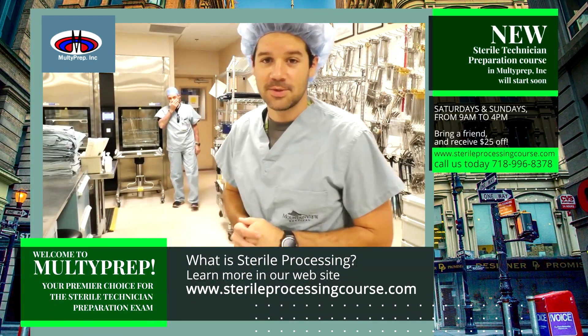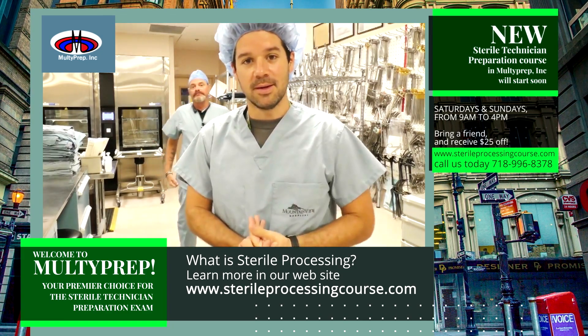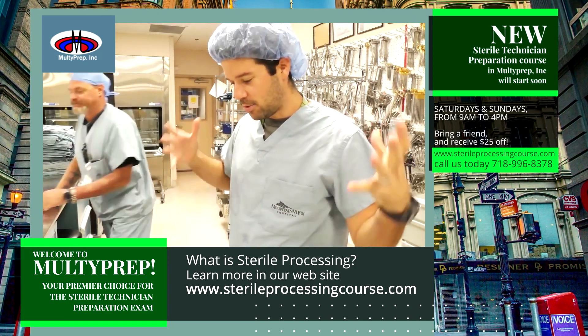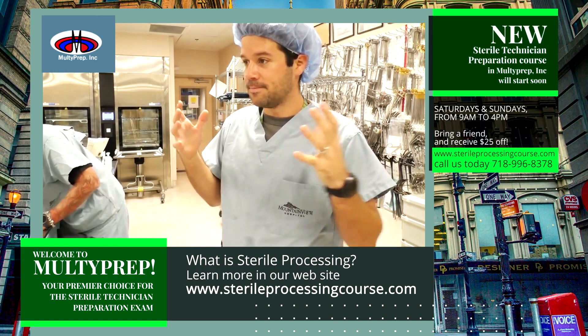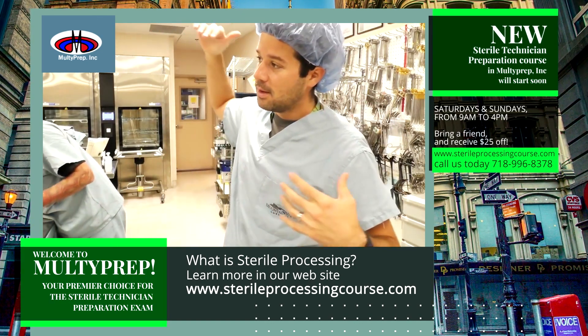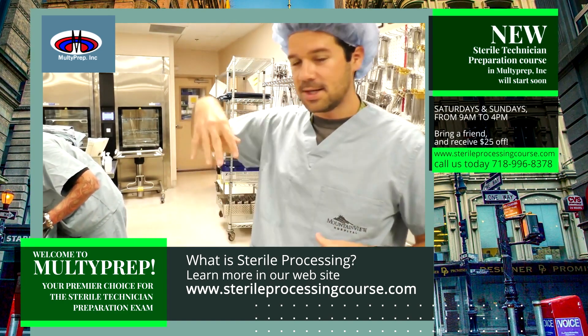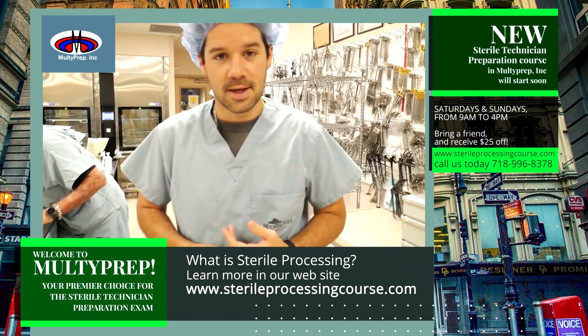Hey guys, welcome back to another Surgical Tech Tips. Today we are in the sterile processing department and I'm going to take you through the steps of a dirty tray where the instruments are coming from the washers, go through the sterilization processes, and just kind of take you on a little tour around this department.